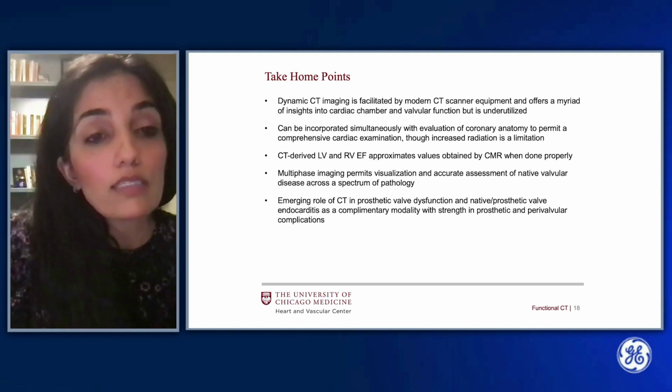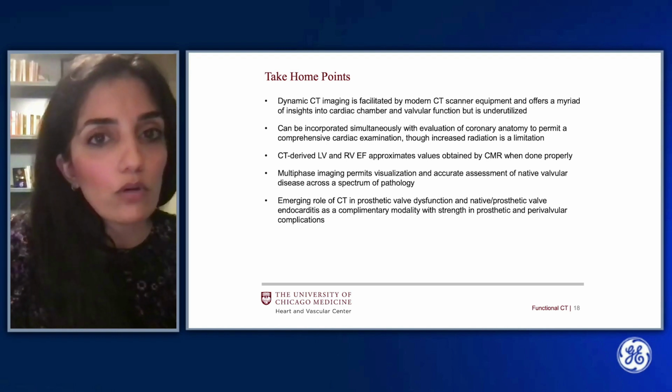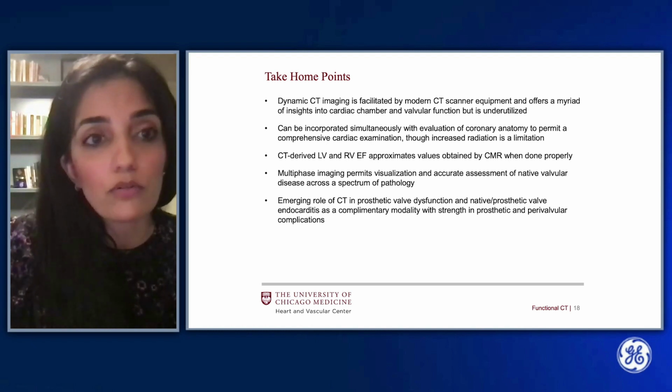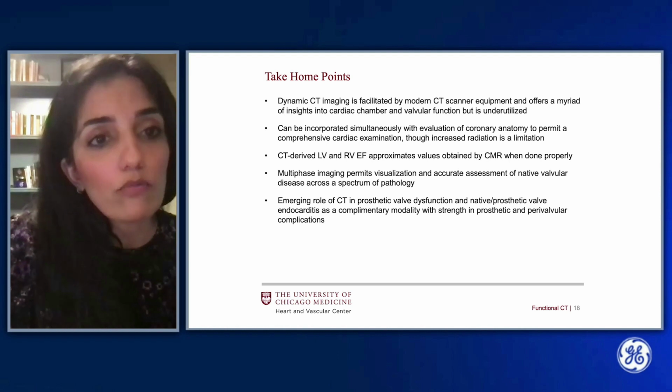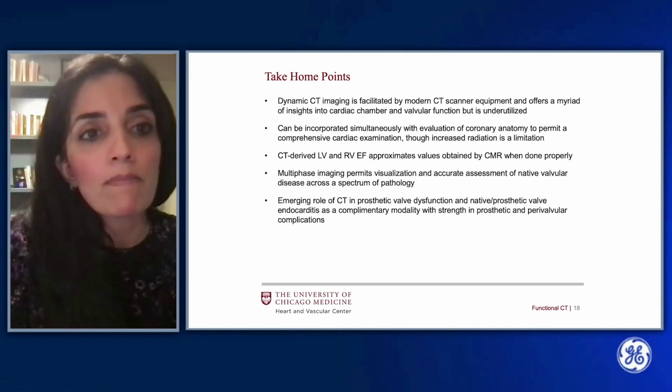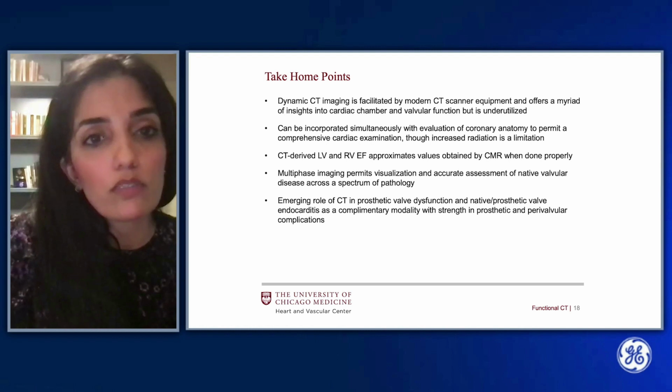It can be incorporated simultaneously with evaluation of coronary anatomy to permit a comprehensive cardiac examination, though increased radiation is a limitation of this approach. CT-derived left ventricular and right ventricular ejection fraction approximates values obtained by cardiac MRI when performed properly. Multi-phase imaging permits visualization and accurate assessment of native valvular disease across a spectrum of pathologies.